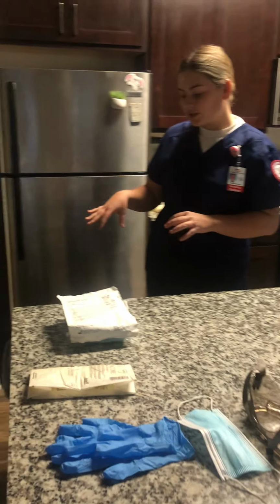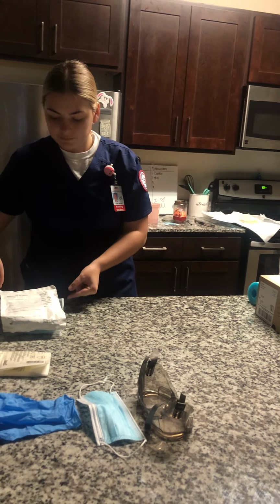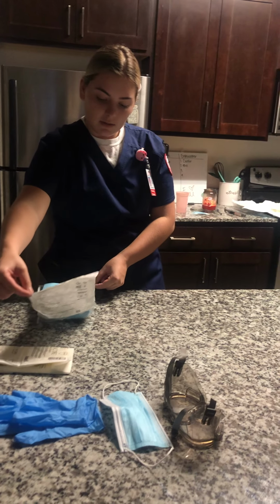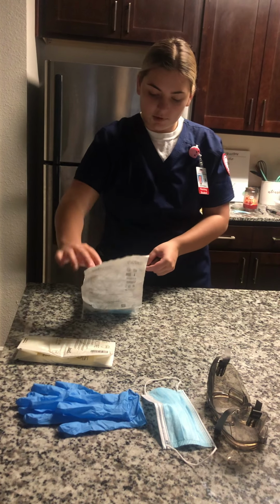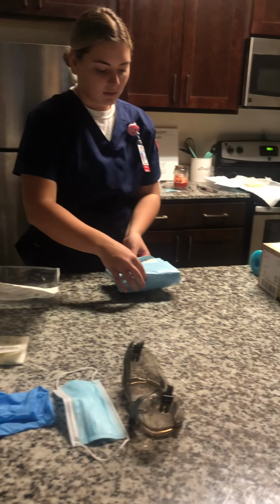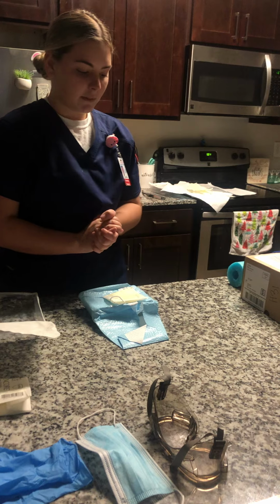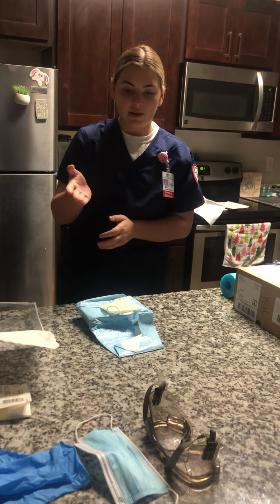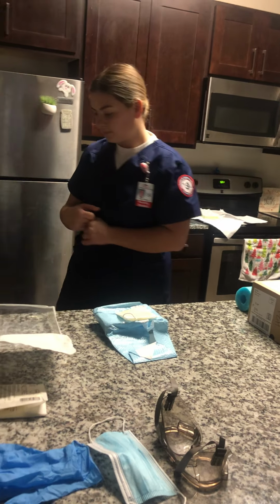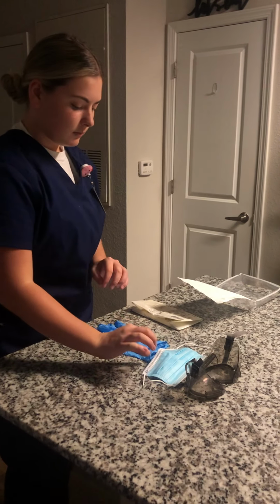I'm going to move my trash can. It's right here, and I'm going to perform hand hygiene. So now I'm going to come over here. I'm opening my central line dressing change and removing it. And I'll open that. So now I'm going to come over here, and I'm going to apply my mask and gloves. Mask and goggles.